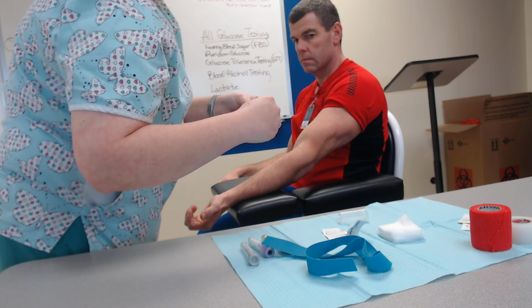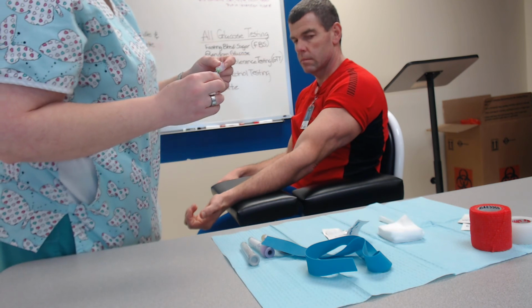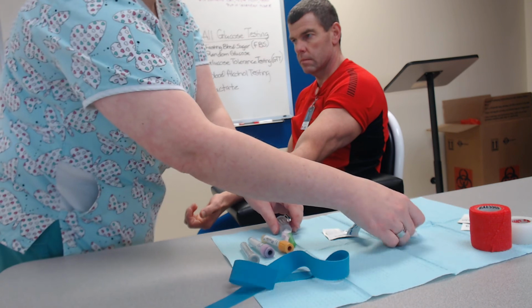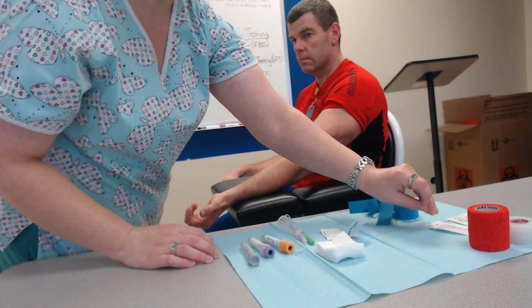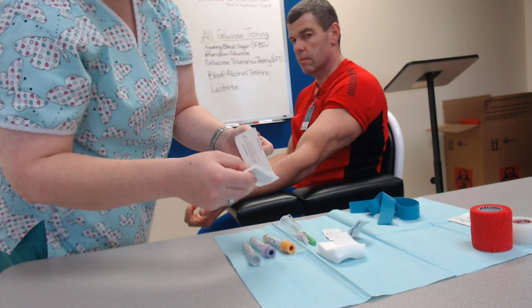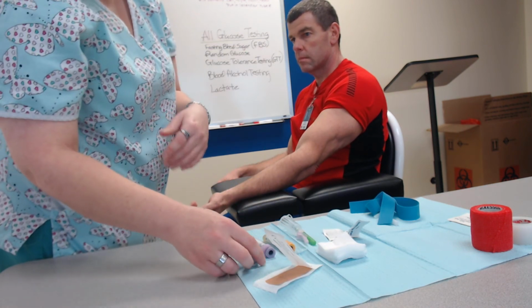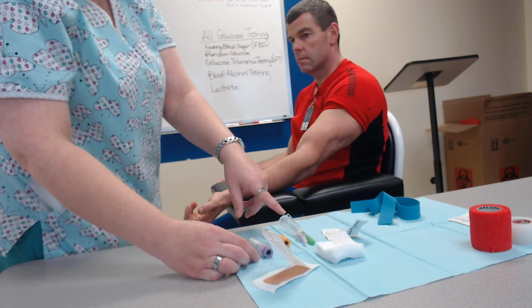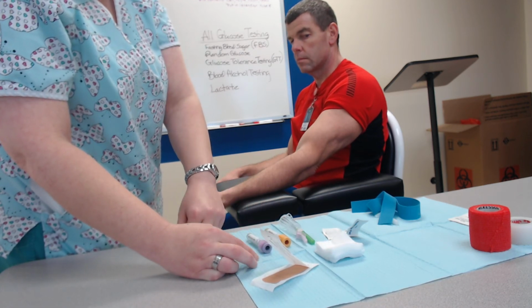So if you're doing a straight venipuncture needle, you'll take the back off of your needle and screw it into your holder. You want to make sure that everything is on your non-dominant side so that you don't have to reach across the patient. And you also want to make sure that your bandage or whatever you're going to use to cover up the area afterwards is open so you can get to it quickly. And then you want to make sure that your tubes are in right order. So going back to our chart, we have your gold tube, then your lavender tube, and then your gray tube.